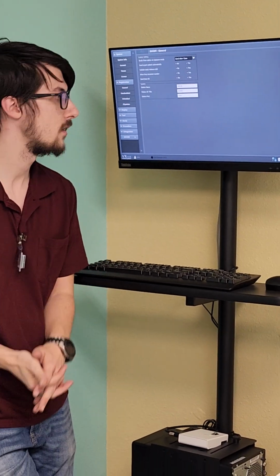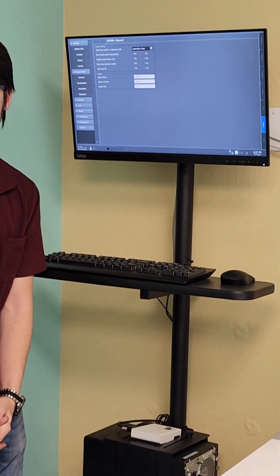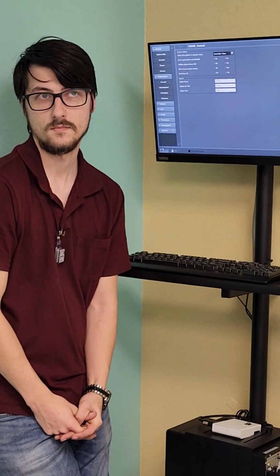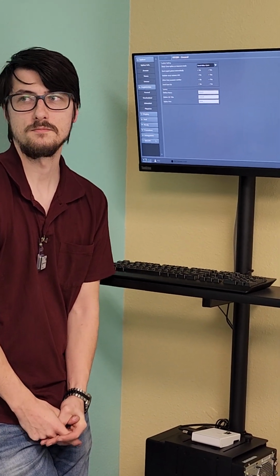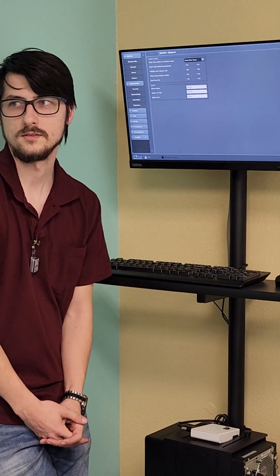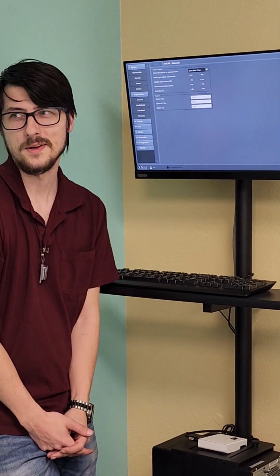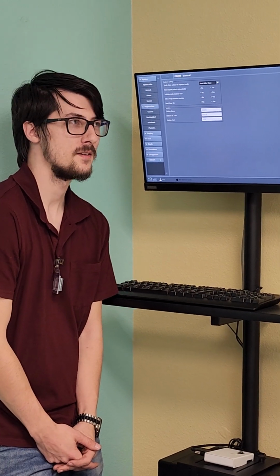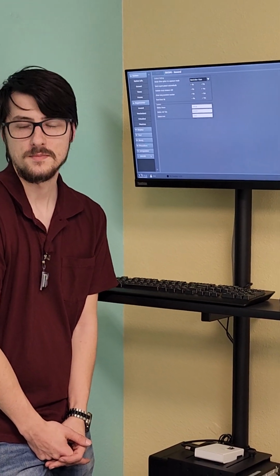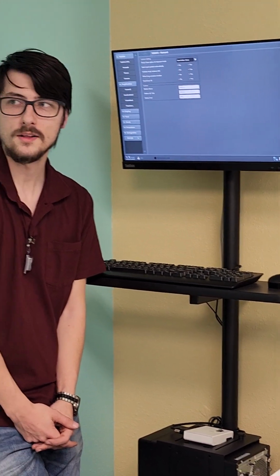At what percentage? Is there a regular percentage increment that you recommend, like, when you hit such and such percentage, go ahead and back up? How many images do y'all normally take in a month or so? Would you say that's a medium amount? Then it might be a year, a couple of years in the future that you would have to worry about that.